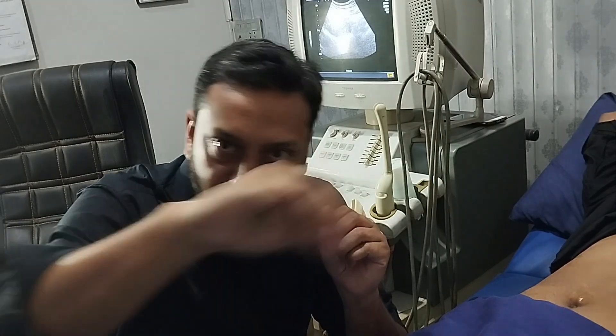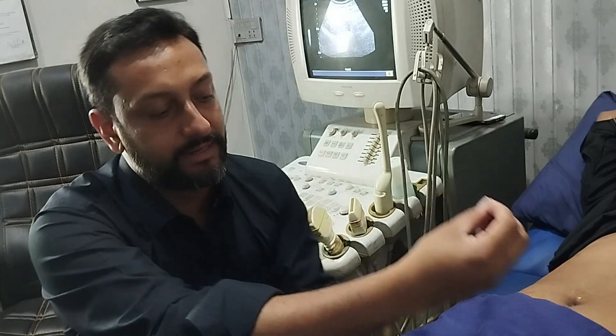You will be evaluating all the parts and organs of the abdomen in a single systematic way. I am emphasizing one key point: we are not supposed to move our probe in a haphazard manner. We have to stabilize the hand, keep it firm, and not push too much — just apply gentle pressure so that gut gases are dislodged and you get better visibility. The movement of the hand should be at the wrist; your elbow should be in a stable position. Move the probe with your wrist — we are not cooking, we are diagnosing. Move your wrist just a little bit and all organs will be visible.